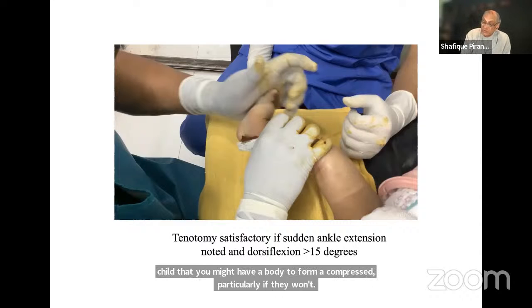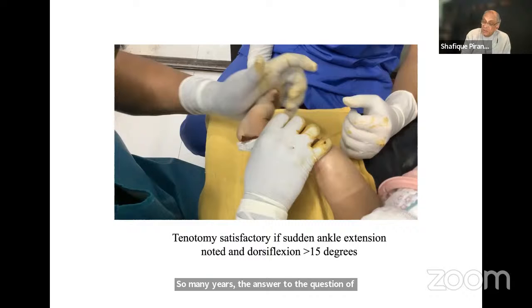The answer to the question of when do you do lengthening of the Achilles tendon versus a tenotomy, that answer has changed. In Dr. Ponseti's earlier writings, he said you should do a percutaneous Achilles tenotomy under 1 year of age and open tendo Achilles lengthening above 1 year of age.